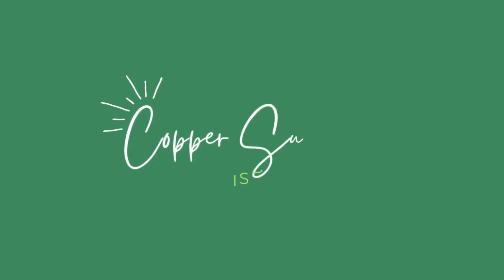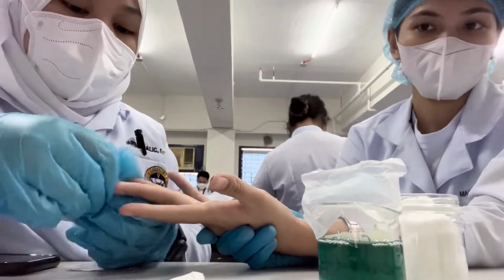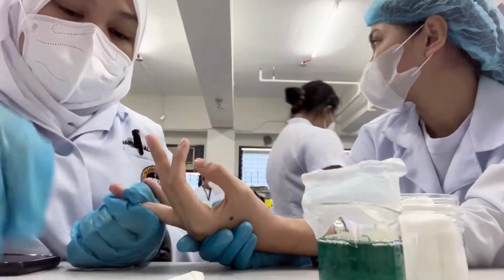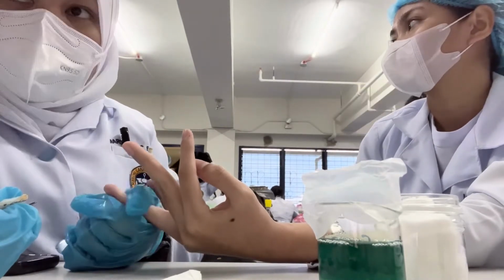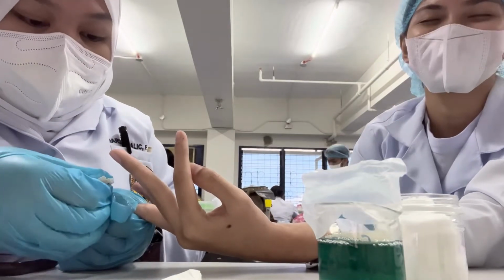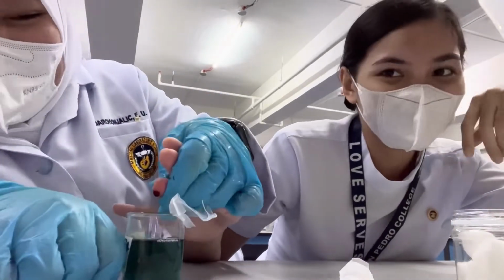And for the last test is copper sulfate. This is done to determine the hemoglobin level of the donor. Step 1 is to massage the finger to promote blood flow. Step 2, disinfect with alcohol. Step 3, using a feather lancet or a pricker, prick the finger. After pricking, wipe the first blood and allow the remaining blood to drop in the copper sulfate solution.